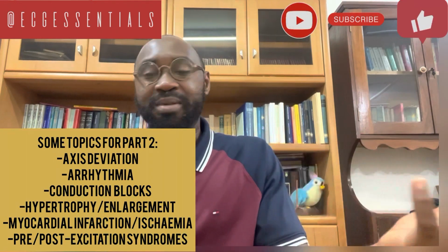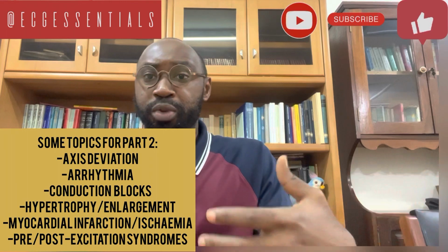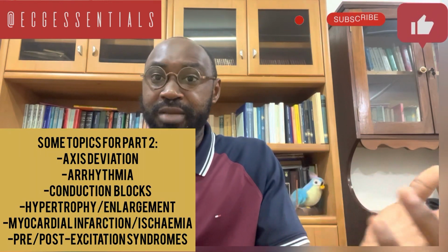We'll also be looking at concepts like conduction blocks, AV blocks, bundle branch blocks. We'll be looking at hypertrophy of the ventricles, enlargement of the atria. We'll be discussing myocardial ischemia and infarction, pre-excitation and post-excitation syndromes. So we have a list of topics, specific abnormalities that we'll be delving into pretty soon.